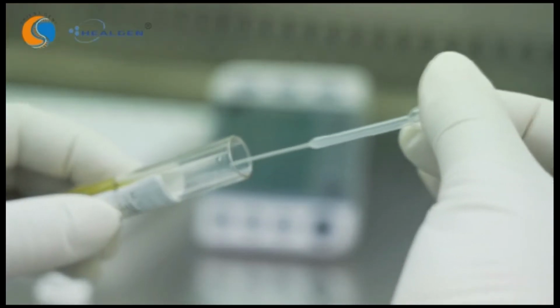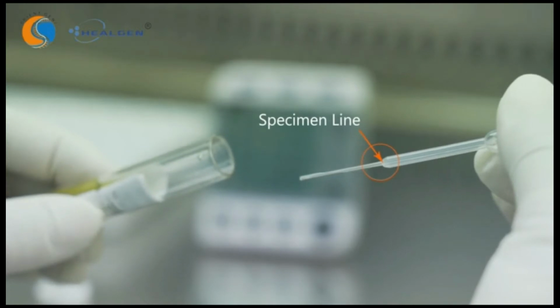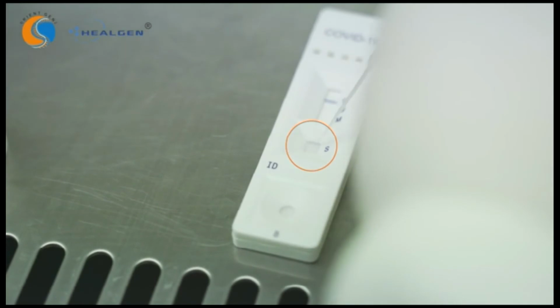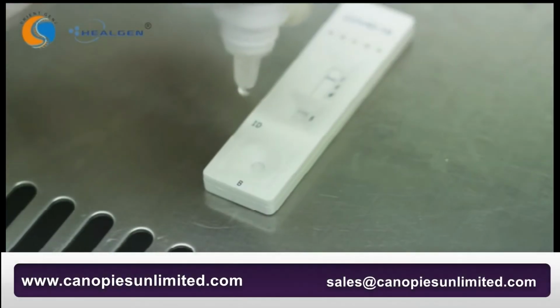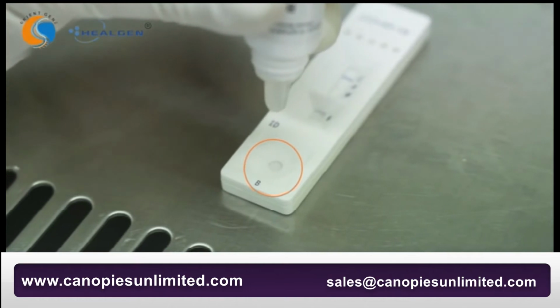When using a disposable dropper for a serum or plasma specimen, draw specimen until it reaches the specimen line. Hold the dropper vertically and transfer 1 drop of drawn specimen into the sample well labeled as S on the test cassette. Then add 2 drops of buffer to the buffer well labeled as B immediately after.